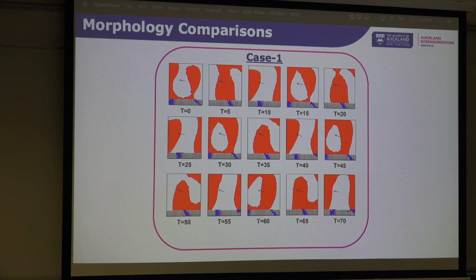And what we're showing here is that as the blue dots, which represents the serosal activity, move across the electrode array, we have the exact same pattern, or a very similar pattern, occurring on the EGG moving across the body surface. So this indicates that our data is accurate, what we're recording is actually what we say it is. And also that we can actually tell the direction of that movement of that wave on the body's surface, as well as that it's stable across time.